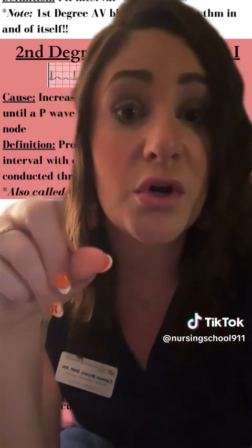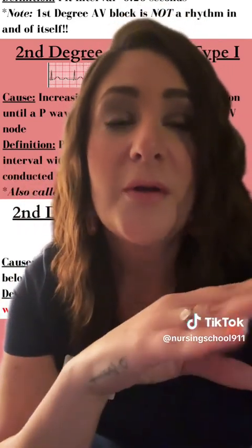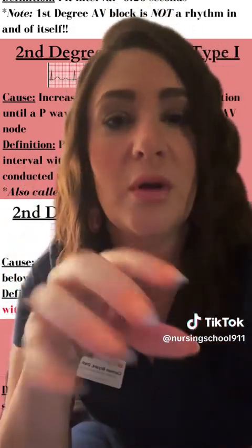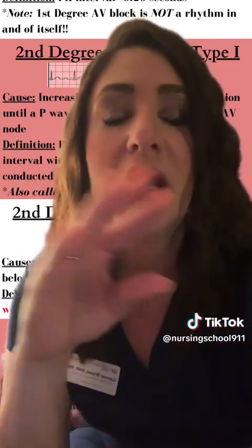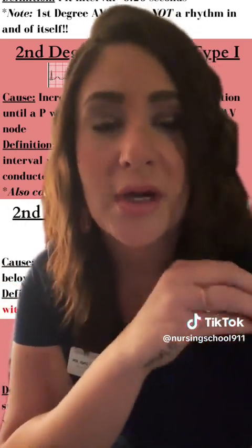And so this is the first type of block that we're going to talk about. So it's a first degree AV block. Note, a first degree AV block is not a rhythm by itself, okay? It's either going to be sinus rhythm with a first degree AV block, sinus brady with a first degree AV block, sinus tach with a first degree AV block.